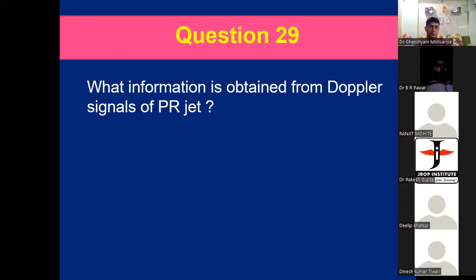Dr. Bhimrao Dhruv Singh Pawar, question for you. What is the importance of recording PR jet signals? No, sir, I don't know this. Next, Rakshit Bhardwaj. Rakshit, are you there? Ankan Patel. Yes, sir.